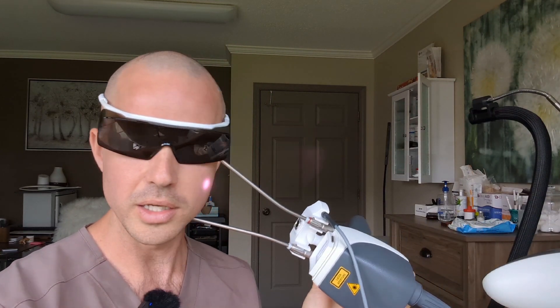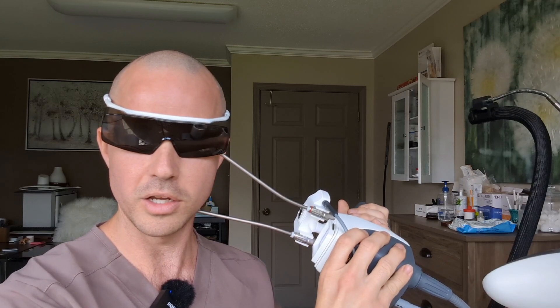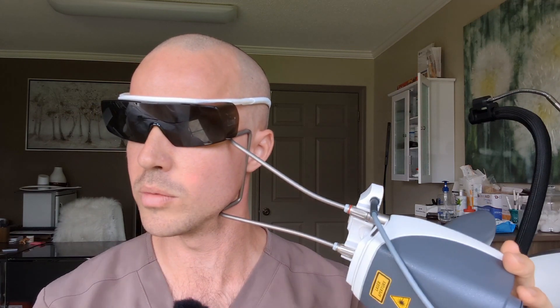I can follow the temperature here on my device — I'm at 40 degrees. Once I hit 42, I switch over and do the other cheek. Now my cheek just feels really pleasantly warm. This isn't going to damage my hair; this could actually help increase beard growth. It's not going to be as effective as if I used my Erbium YAG laser, but it will help. All I'm going to get is temporary redness of the cheeks — that's actually going to be like a nice glow, like I kind of finished a workout and my face is a little flushed. So this is something that's very easy to do on one's lunch break.